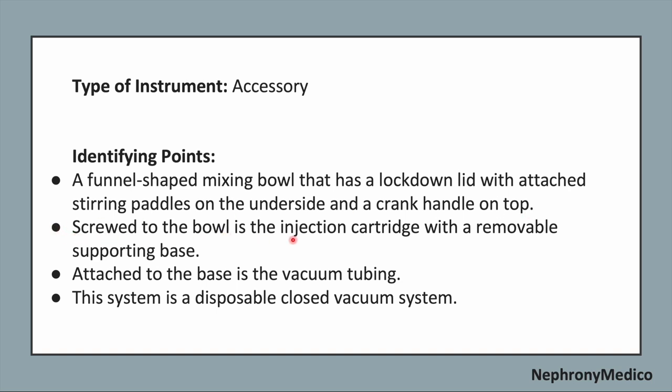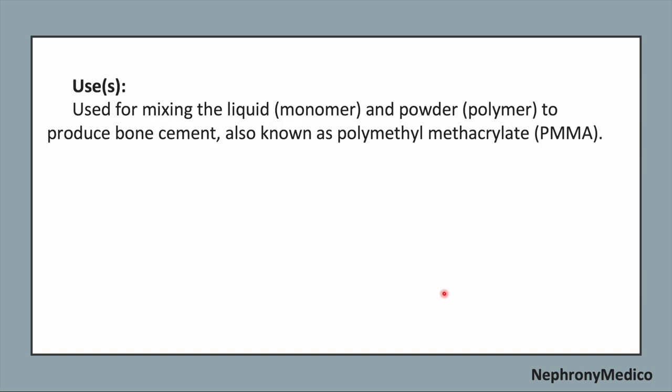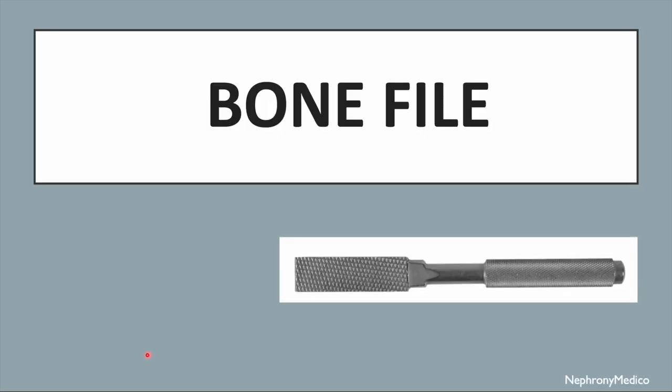Screwed to the bowl is the injection cartridge with a removable supporting base. And attached to the base is the vacuum tubing. This system is a disposable closed vacuum system. Now, use: it is used for mixing the liquid and powder to produce bone cement, also known as polymethyl methacrylate, PMMA.